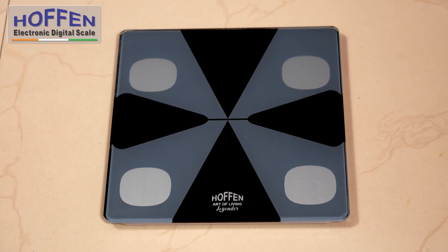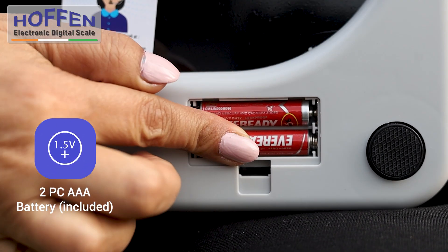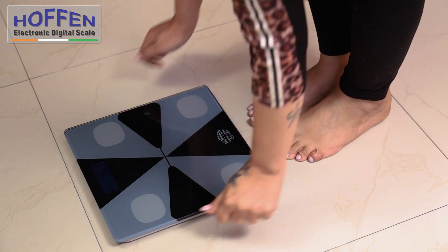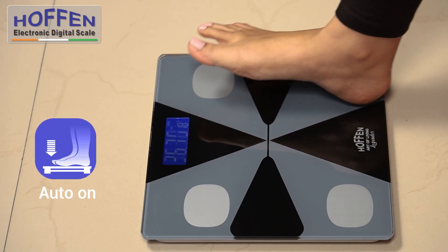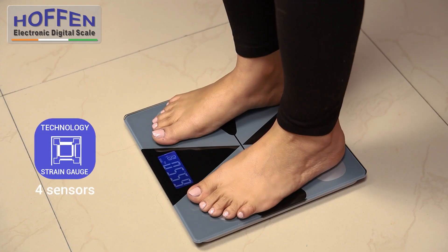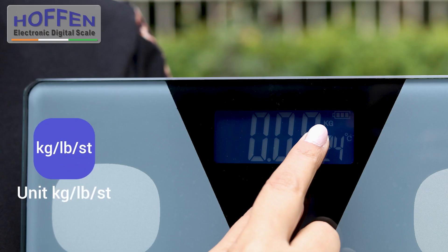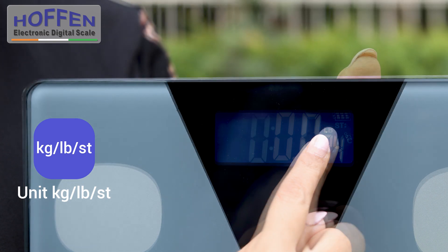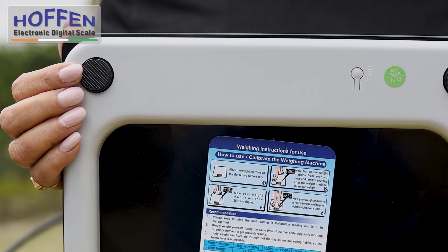This tempered glass scale is stylish and fits any decor. Simply insert two AAA batteries, lay the scale on a flat hard surface, step on and off the scale to calibrate and you are ready to weigh. Its four precision sensors showcase your weight on the large LCD display. The unit of measurement by default is set to kilograms and can be adjusted to pounds or stones by simply pushing the button at the back of the scale.